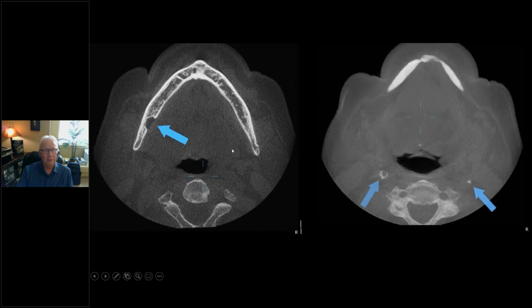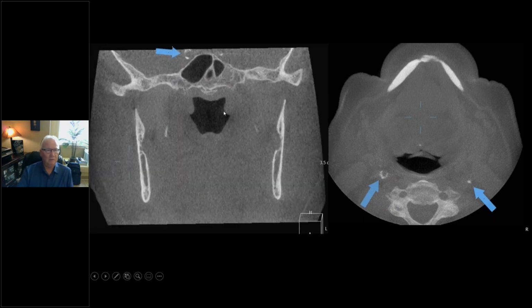When I was imaging this patient, as I went further south, you could see, and this is a MIP image by the way, because I wanted these to stand out, a small circular calcification, and I wondered what that is. So I did a MIP image, thickened it out to 10 millimeters, and found two calcifications. Then lo and behold, in the coronal plane section, I found some up in the sella region. Now, these are in the cavernous segments of the internal carotid artery.